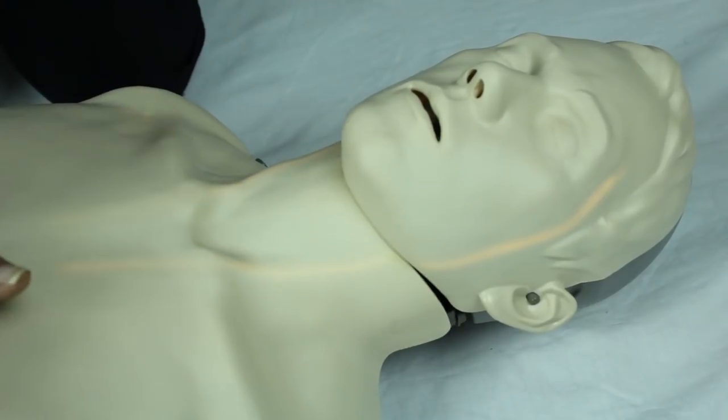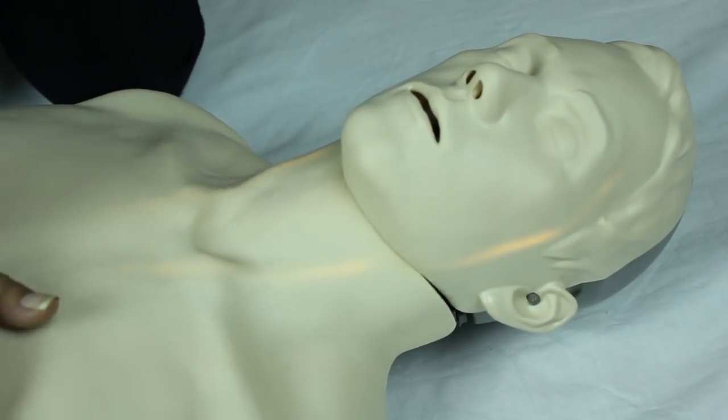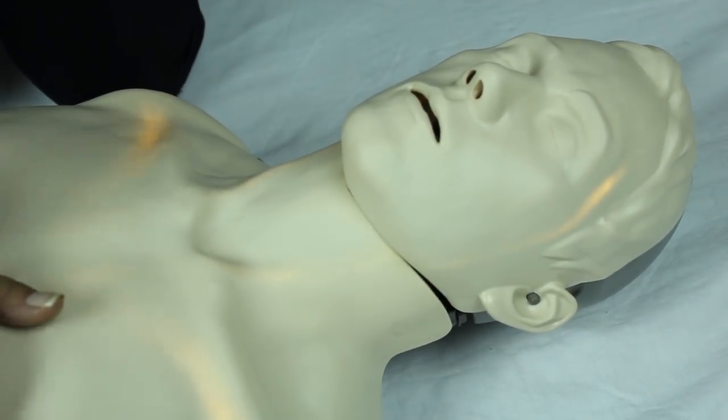The blood circulation indication lights are located along the neck of the mannequin and represent the blood flow from the heart to the brain. The depth and speed of the chest compressions will determine the speed of the blood flow. At the top of the forehead is the normal circulation indication light, which will illuminate when the depth and speed of the compressions are correct.